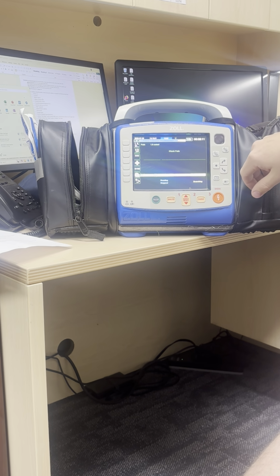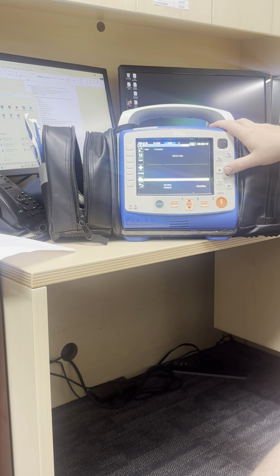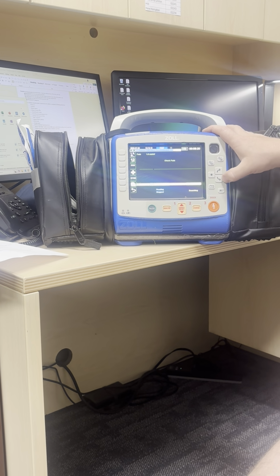To reset it back to adult without changing it on its own, if you have a pediatric patient, turning the monitor off and letting it reset after a couple minutes, it will default start up to an adult patient.